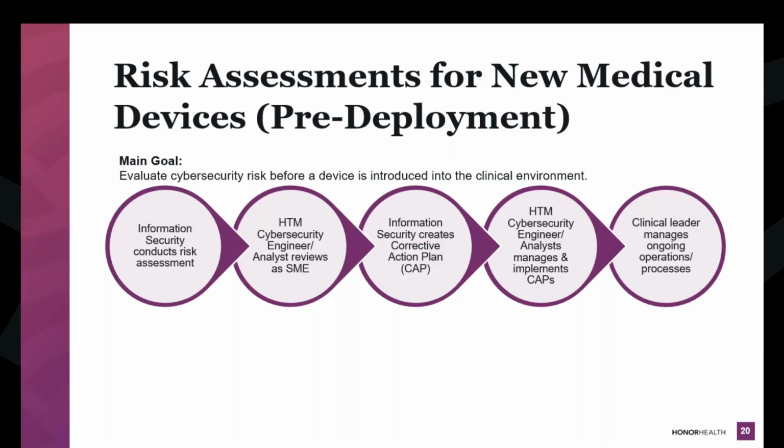In case a physician has questions and wants us to pull the study back up, more than likely that's not going to happen. So they can also look at PACS. So again, work with those clinical leaders to make sure there's an ongoing process in place to make sure that whatever you're saying needs to happen in those CAPs is actually implemented in the real world and it's followed through.